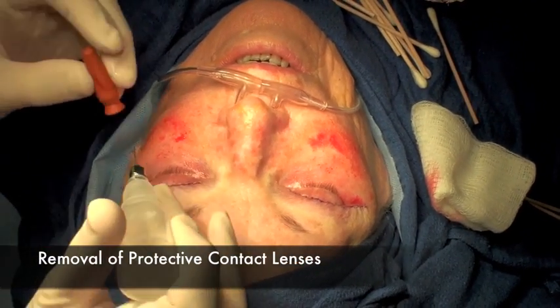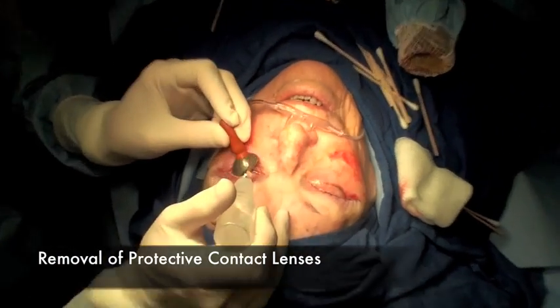At this point, the protective metal contact lenses were removed from both eyes.